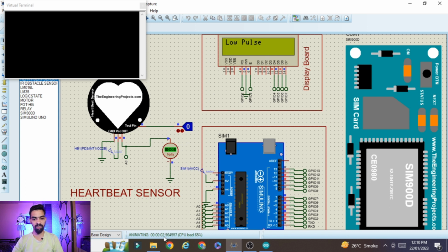Again wait for 10 seconds. After this, like you can see 3 seconds is here, approximately 13 seconds we will get the final count. And right now only one high pulse is detected because we have given only one high signal and then we stop the signal. That's why the count may be 10 or 20, in between 10 and 20. So you can see count is 15, that is low count, below the 30 pulse rate.